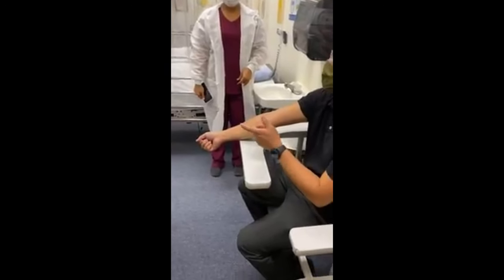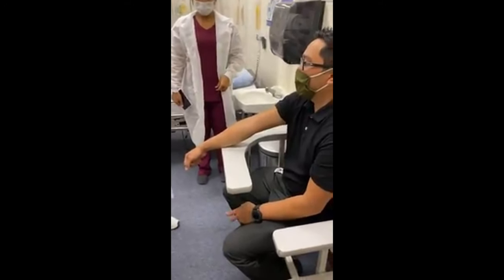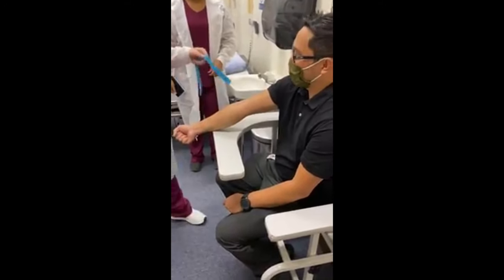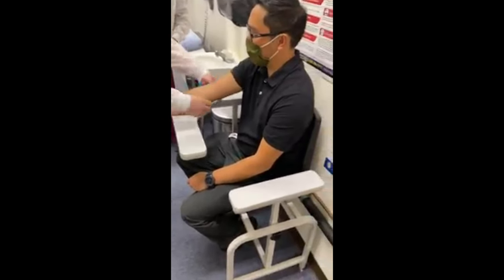With these tourniquets, since you're taking it home, you could practice on your family members. Just make sure to. Okay. Alright, so face this way, relax your arm.